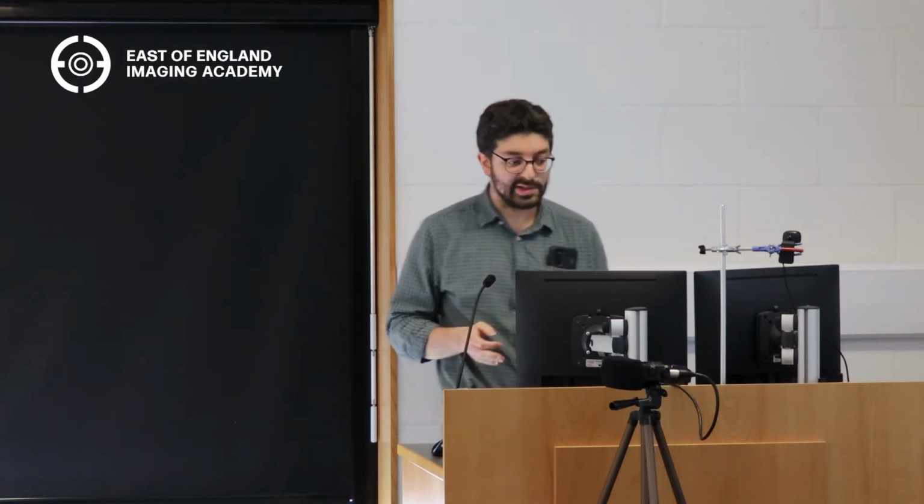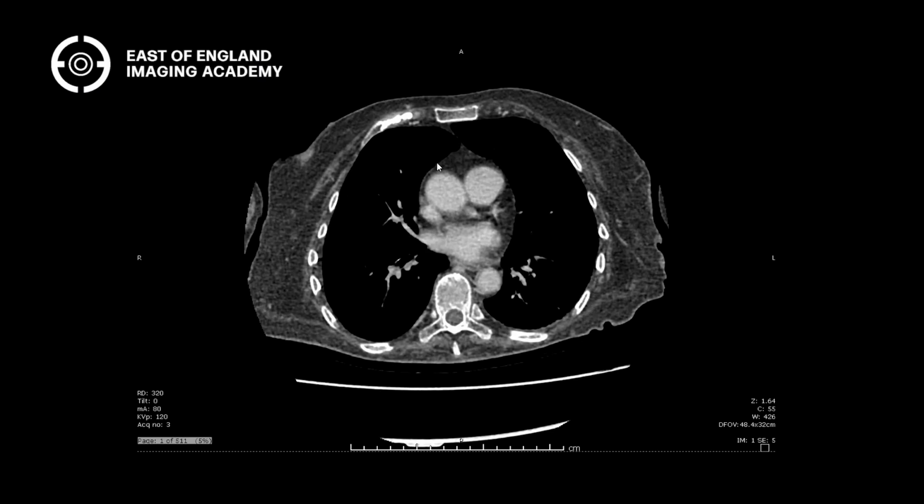So let's have a look at something else. So this is a case where it's quite complicated, okay, but this is the kind of stuff I live for. It's the most fun in radiology when you've got someone who's got lots of things going on. You're trying to put it all together, and it's like a puzzle. It feels a bit like being Sherlock Holmes, sort of putting together a puzzle. So this patient, what's going on?